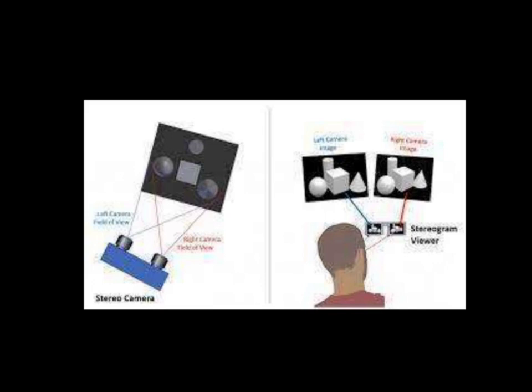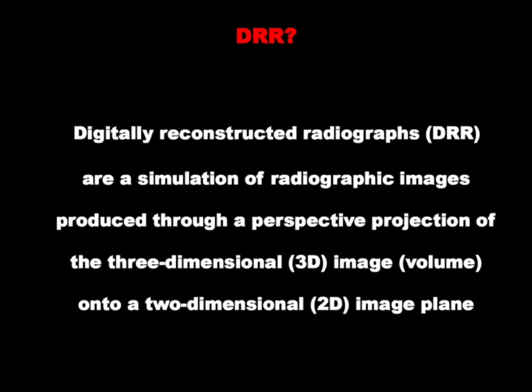So orthogonal imaging forms the basic requirement of radiographic film, that is, two orthogonal projections of a region of interest. You see the AP view, and then at 90 degrees another view is taken, that is the lateral view, so that you can see here the applicators in the AP view and lateral view of a pelvic tumor like in CA cervix planning applicator. So this is an orthogonal film. So what is stereoscopic imaging?